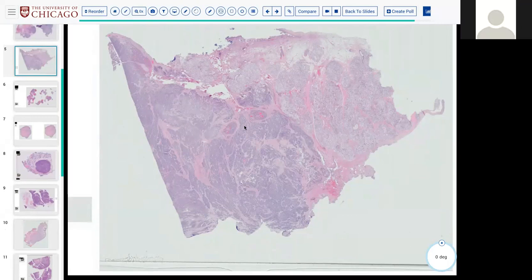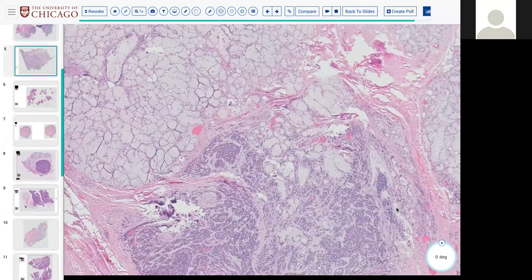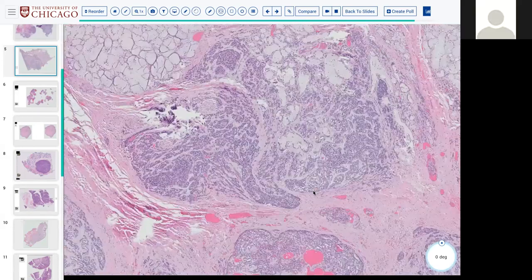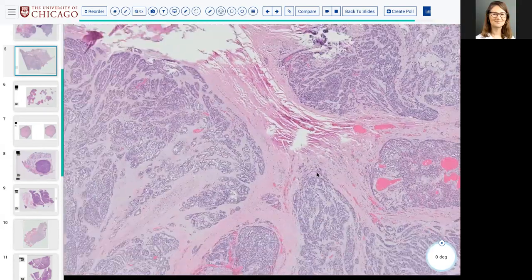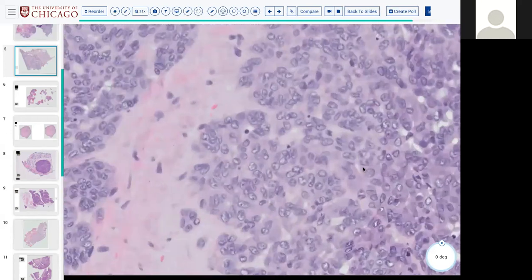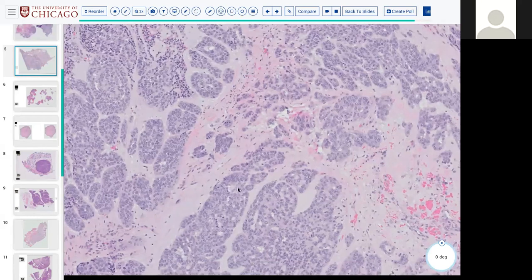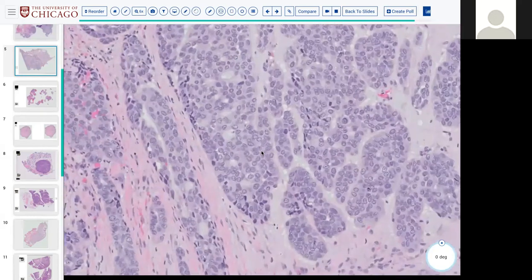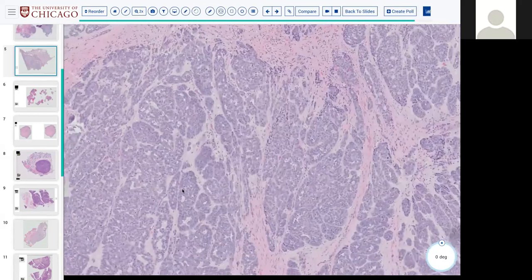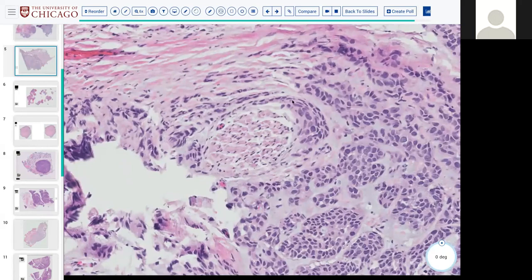Okay, so the periphery looks like normal salivary tissue, and it's predominantly mucinous glands, so it might be sublingual or maybe minor salivary glands. Then when we go to the tumor, it seems that it is infiltrating into the normal salivary gland at this focus. The rest of it seems pretty well circumscribed otherwise. As for the tumor, the cells are arranged in solid and somewhat tubular and cribriform arrangements, with intervening hyalinized to somewhat myxoid stroma. The cells appear more or less monomorphic, with somewhat irregular or angulated and vesicular nuclei. I think I saw perineural invasion in this. I'm not sure where, yeah, we can see it here also.